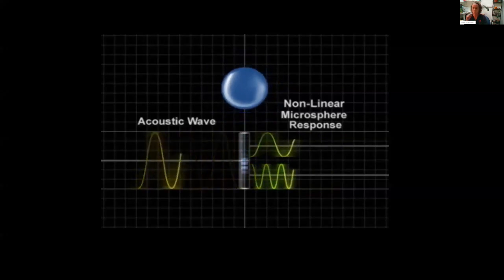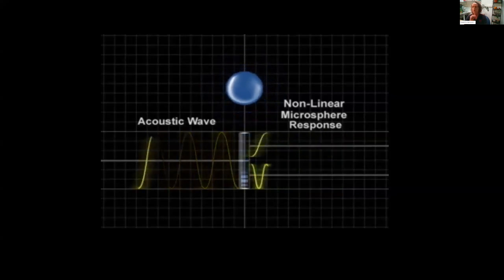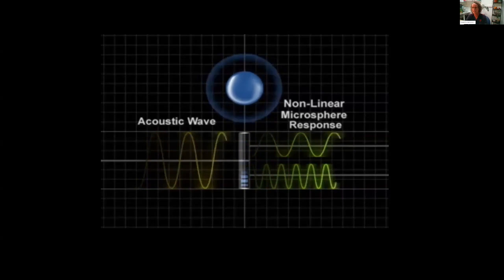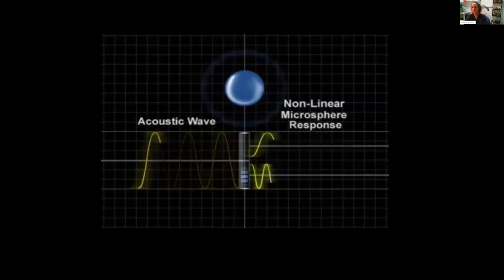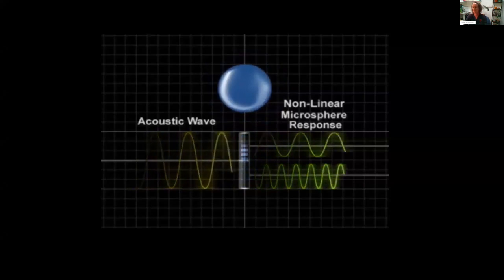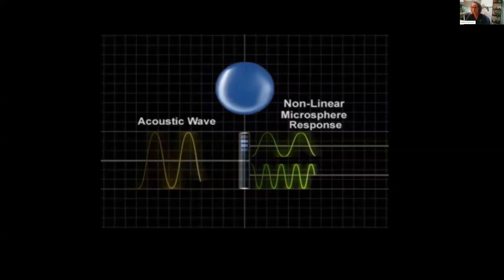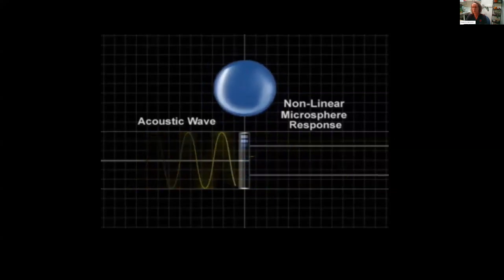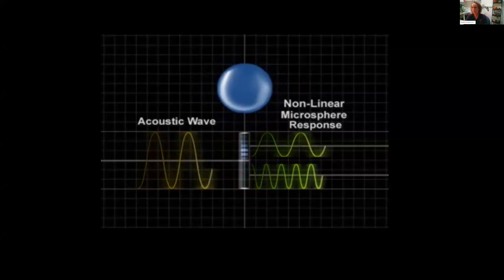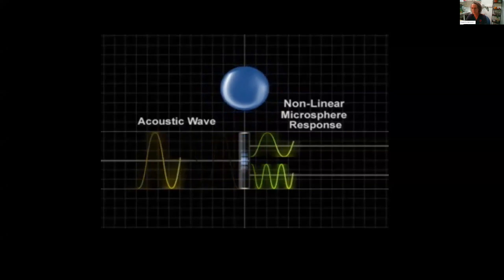Now, microbubbles in a beam of ultrasound undergo resonant oscillations due to the variations in the acoustic pressure that's being transmitted by the transducer, as you can see in this image. While they oscillate, the microbubbles are stiffer when compressed and less stiff when expanded. And this causes the radius of the bubble to change asymmetrically. And then the reflected echoes containing the nonlinear components, called harmonic signals, will be picked up. And we're all familiar with harmonic imaging. It's the default imaging for all our standard transthoracic imaging.